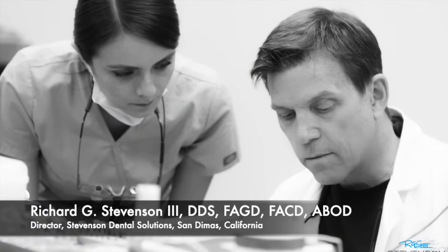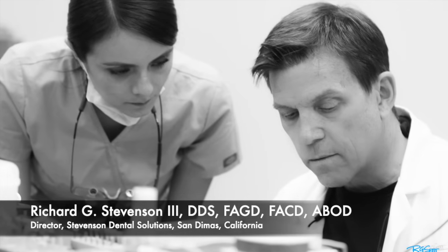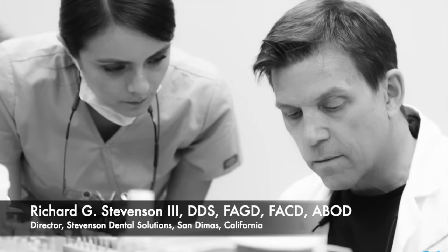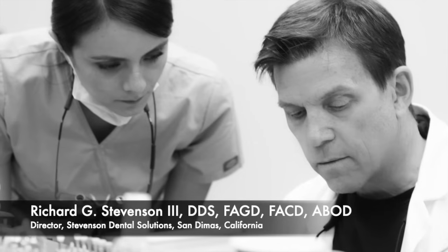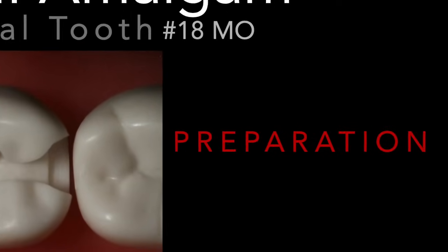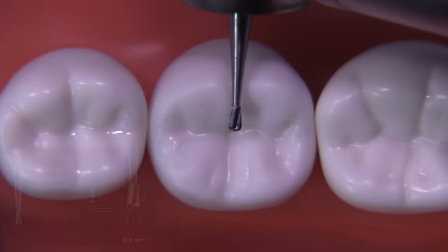Hi everybody. I'm Dr. Richard Stevenson, and I'm the director of Stevenson Dental Solutions in San Dimas, California. We are an ADA SERP approved CE center that focuses on hands-on courses. Today we are going to discuss the preparation for tooth number 18 MO on the typodont. So let's get started.